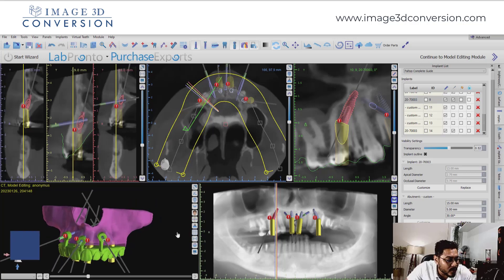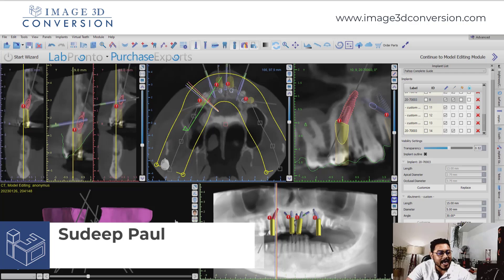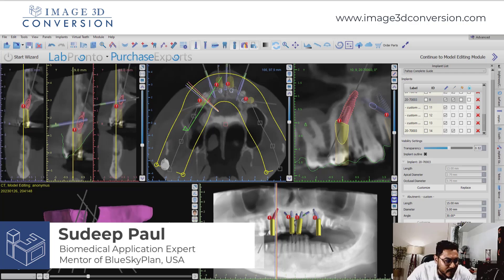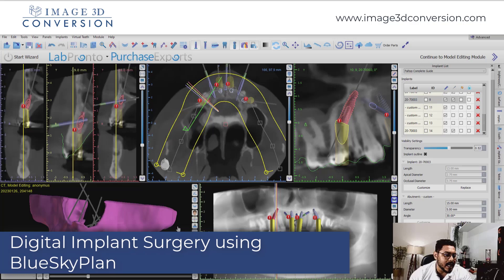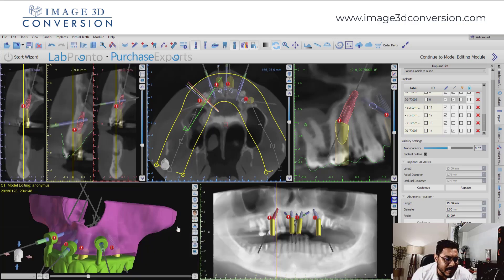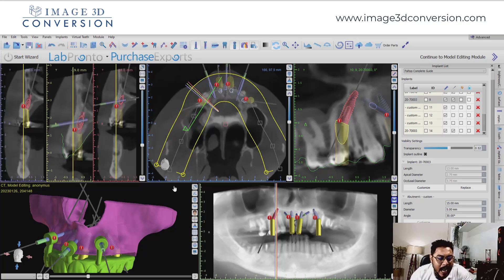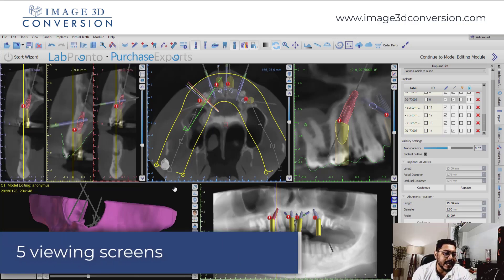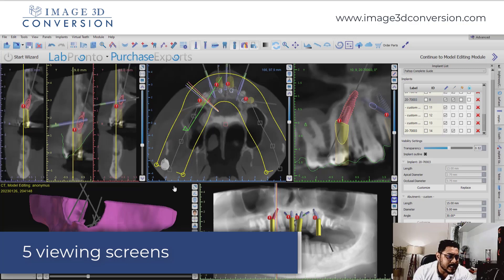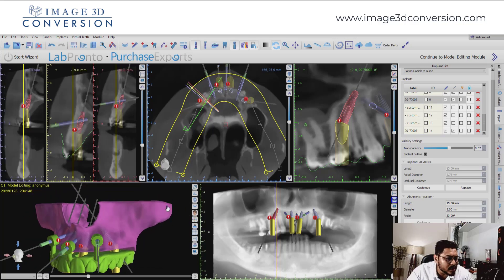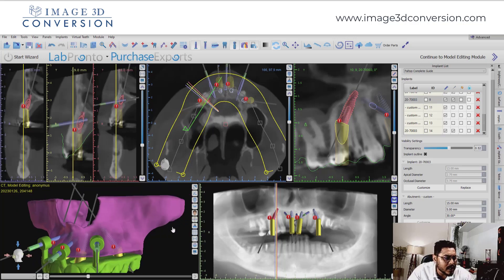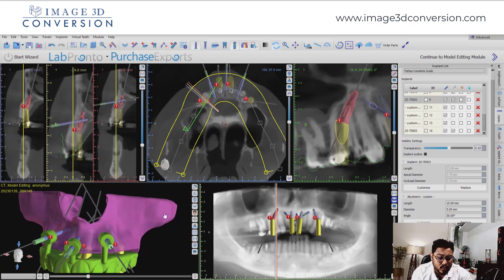Hello everyone, this is Paul, your mentor of digital industry and guided implant surgery. I'm making this video for you to review the treatment plan in a precise way. I've received many queries to make this kind of video so you can go through the treatment plan from the right angle that I generally share in my courses.